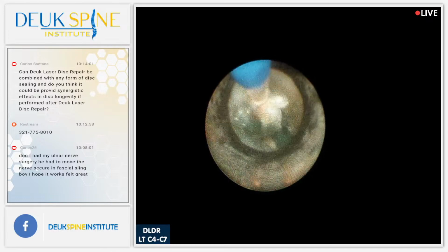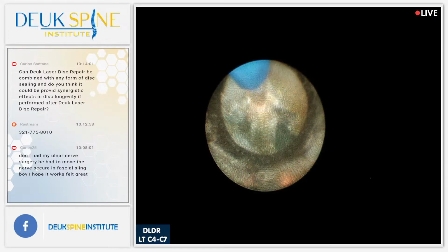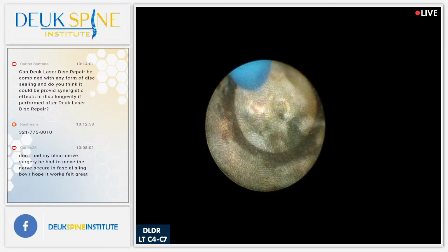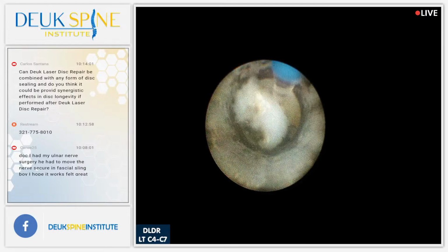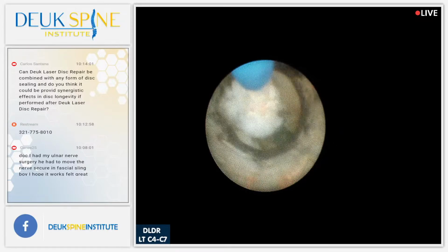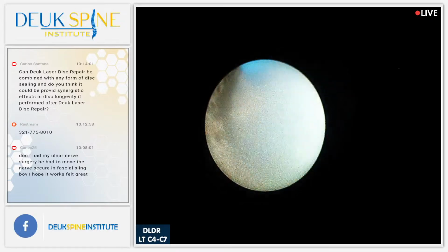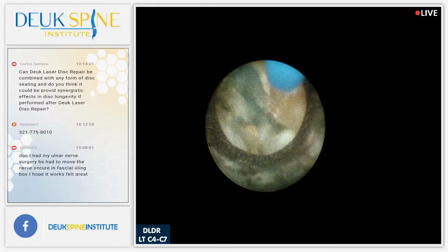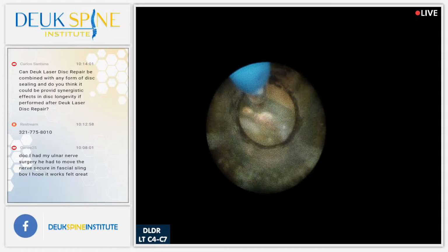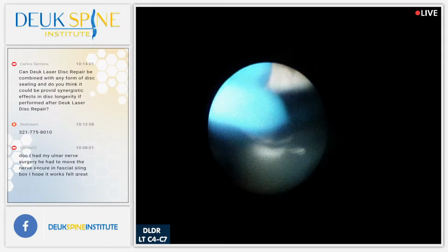But my wife told me, "You know what, just go. See what they're doing. Maybe you'll learn something." And I was like, "Sure, whatever." So I listened to her. And as a result, there's a herniation, by the way. I'm trying to cut this herniation in half because it won't fit out of the tube. So as a result of me going and watching these surgeries from these Korean doctors and German doctors, these pioneers in endoscopic spine surgery, I quickly learned that, my God, this actually works.